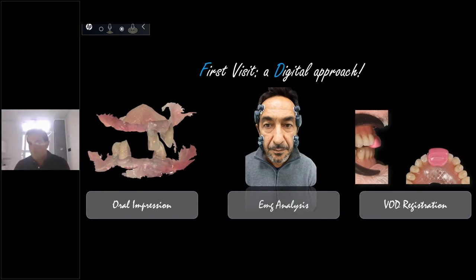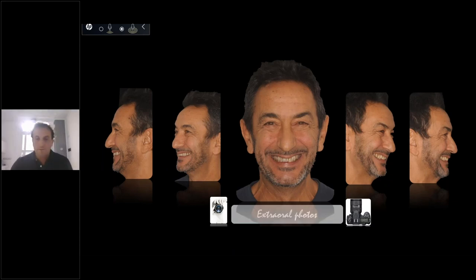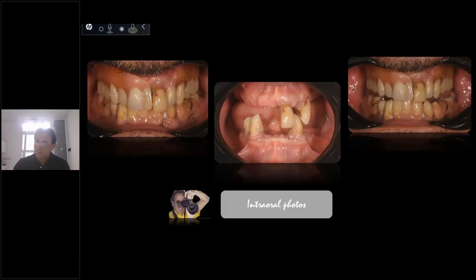Absolutely. There's the calibration that can erase some issues with the probe positioning, but consider that taking a picture, of course, can help you even better to maintain a very similar position.